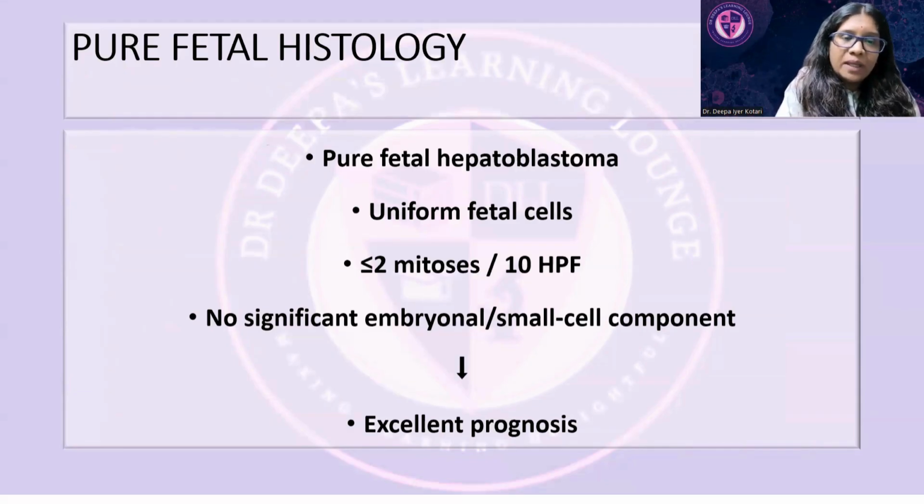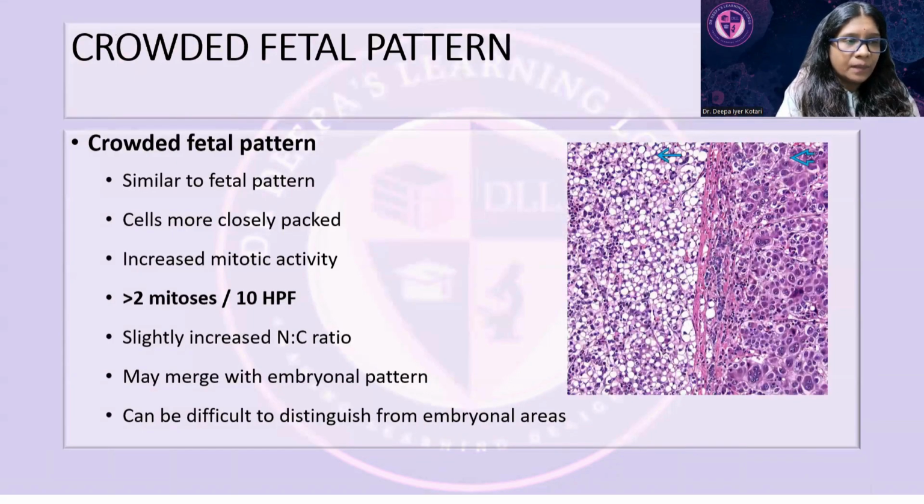And the tumor can be classified as a pure fetal type. Pure fetal type of hepatoblastoma is associated with an excellent outcome, and also stage 1 hepatoblastoma of pure fetal type can be completely surgically cured. Therefore, recognizing this has very good clinical relevance.